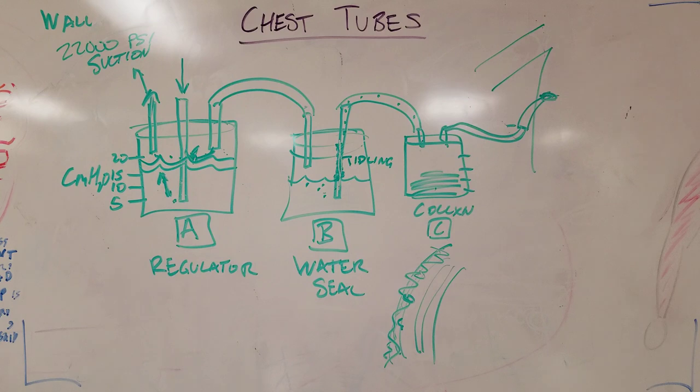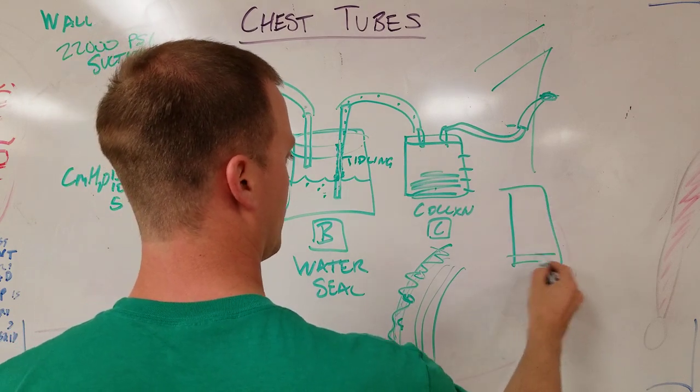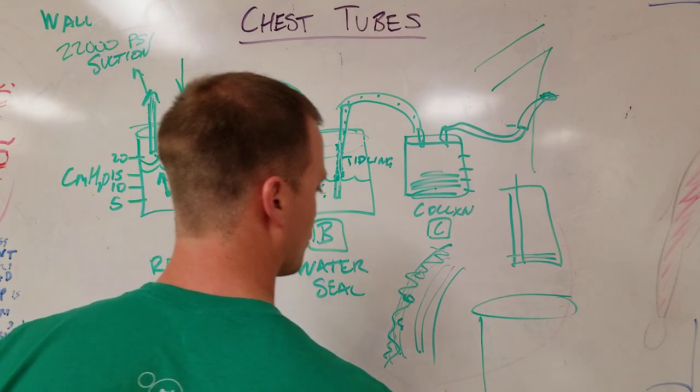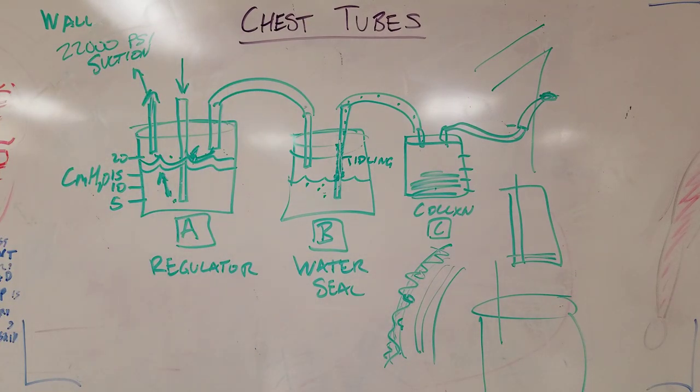So imagine we're back at the restaurant, and you have your little glass of water, and if that glass has just a little bit of liquid in it, and you stick your straw in and you blow, you'll blow huge bubbles super easily. You don't have to push a lot with the air that you're blowing in. Conversely, if you went up to a huge bucket or a 55-gallon drum, and you stuck a straw in there and tried to blow bubbles, the deeper you go inside that drum, the harder it is to push bubbles, right? If you stuck a straw into a swimming pool, you would not be able to blow bubbles for the life of you, depending on how deep you were. And that's the same thing here.